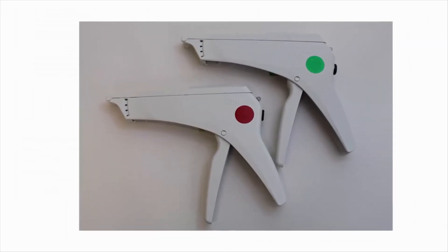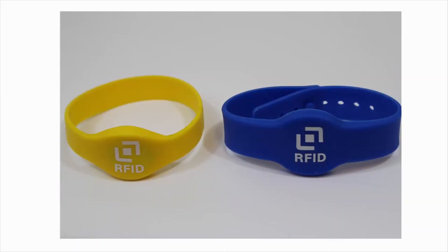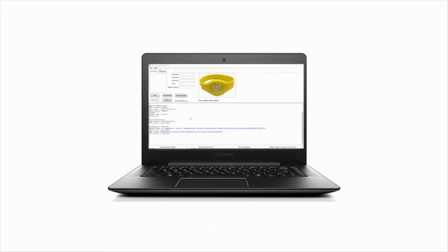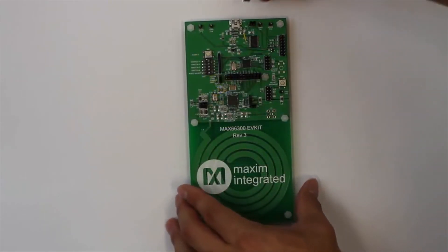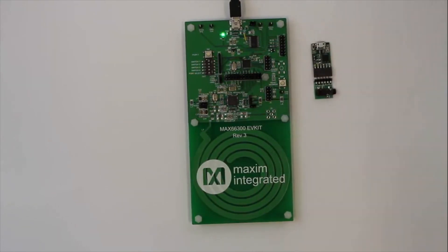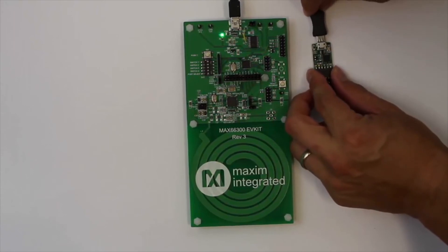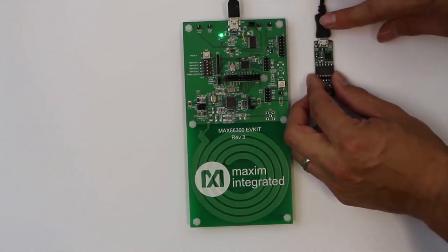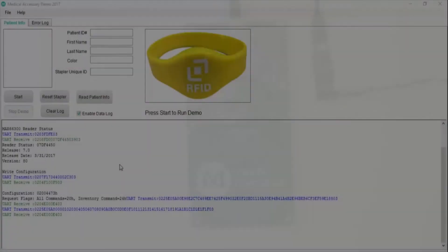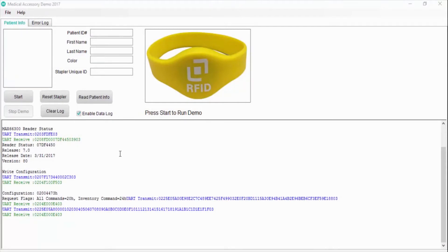The stapler with the red sticker represents an unauthorized accessory. The stapler with a green sticker represents a manufacturer-authorized accessory. The MAX66242 is being used as an NFC tag inside the wristband, which represents two different patients. The stapler contains the OneWire DS28E36 DeepCover Secure Authenticator. The PC is the host portion of the solution and runs software to emulate a medical procedure. To start the demo, I need to connect the MAX66300 NFC reader and the OneWire adapter to any available USB ports, providing the necessary communication from the PC software to the hardware.